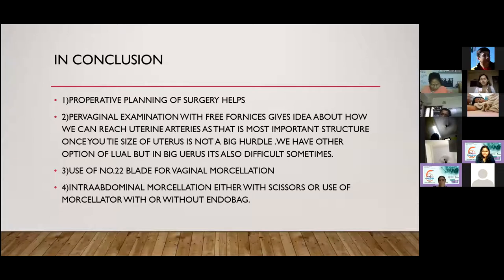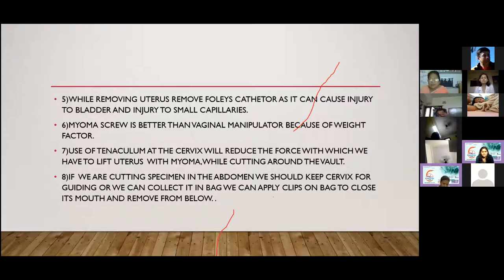We can chop the uterus into halves and keep the cervix for guidance. After removing one part from the vagina, hold the other side of the uterus with an Allis and remove it. Morcellator-in-bag morcellation and other methods are also available while removing the uterus.